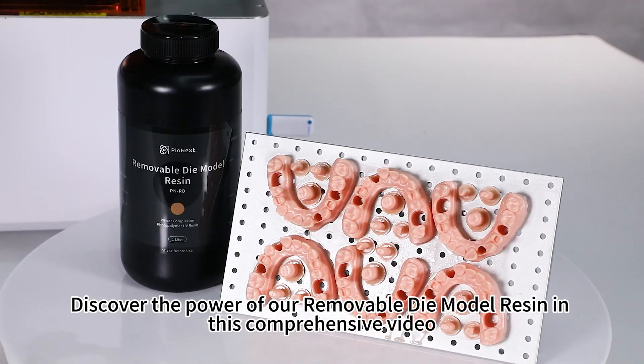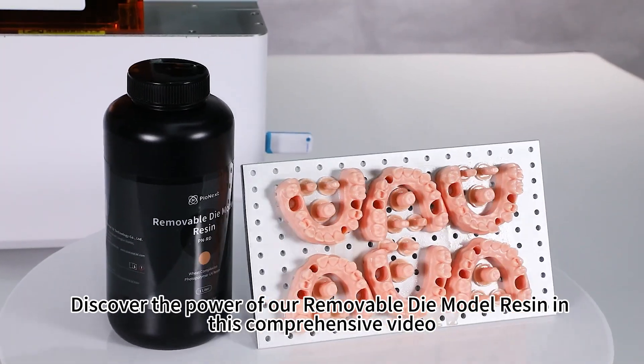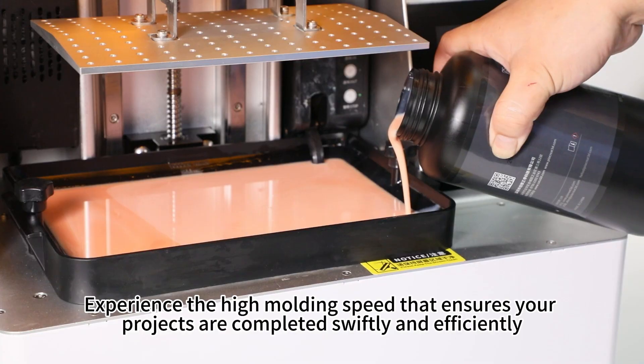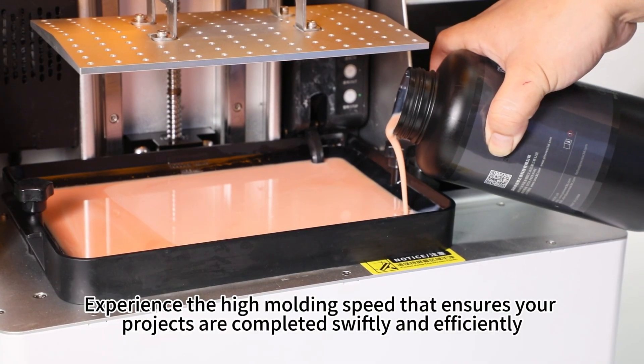Discover the power of our removable die model resin in this comprehensive video. Experience the high molding speed that ensures your projects are completed swiftly and efficiently.